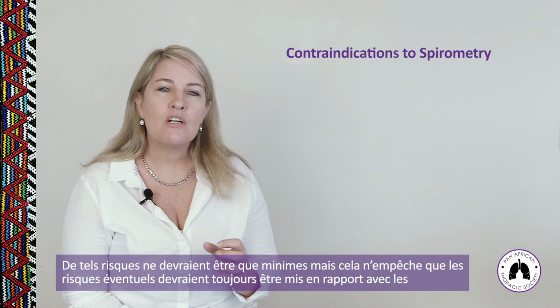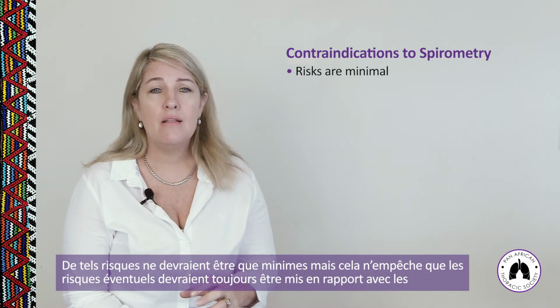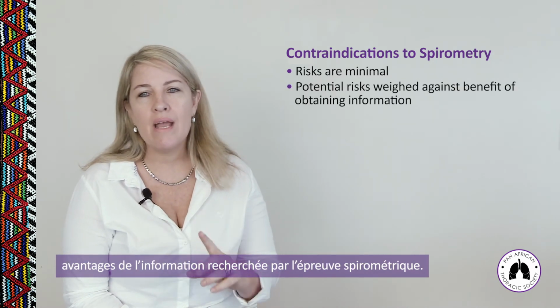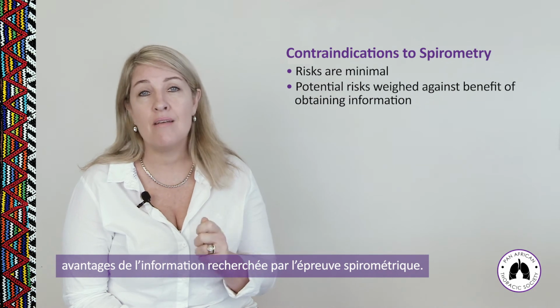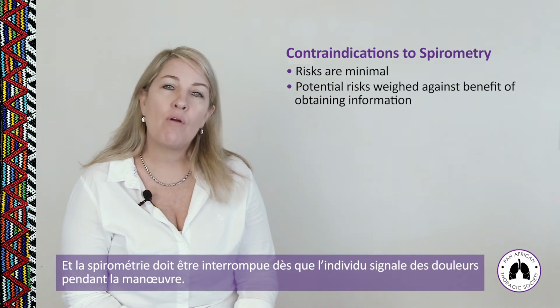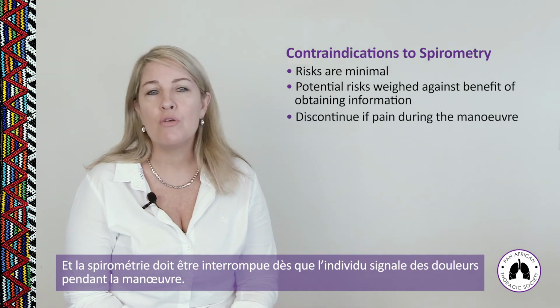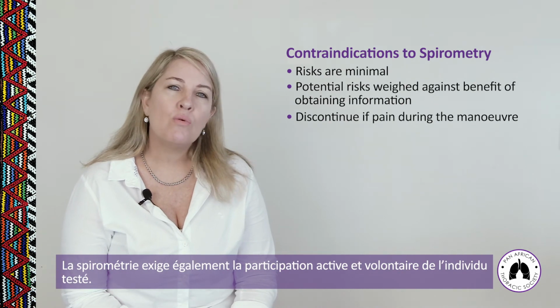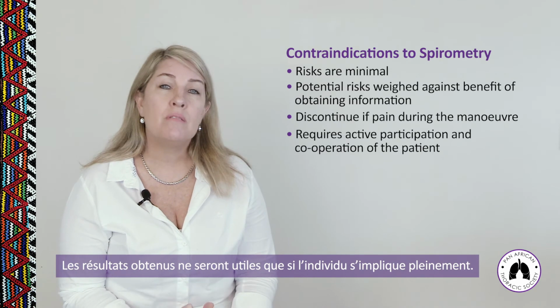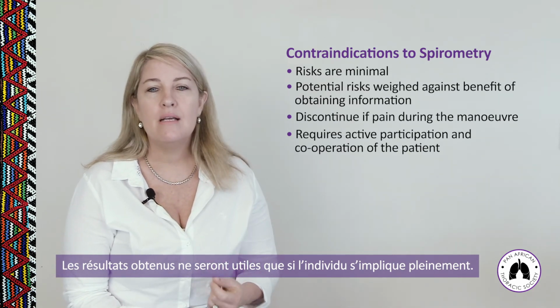So although such risks are likely to be minimal for spirometry in most patients, the potential risks associated with testing should always be weighed against the benefit of obtaining that information from the spirometry test result. And spirometry must be discontinued if the patient has any pain during the maneuver. Spirometry also requires the active participation of the patient. So to obtain useful measurements, cooperation during spirometry testing is necessary.